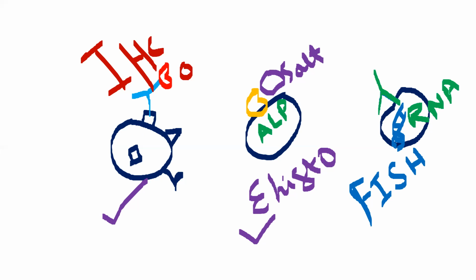So these are the three major fields of advanced histochemistry, and these are the three important units you have in your syllabus. You have immunohistochemistry, detection of cellular proteins or antigens with the help of antibodies. The second one is enzyme histochemistry, where we are detecting cellular enzymes by using some substrates. Then we also have a specialized advanced technique called FISH.